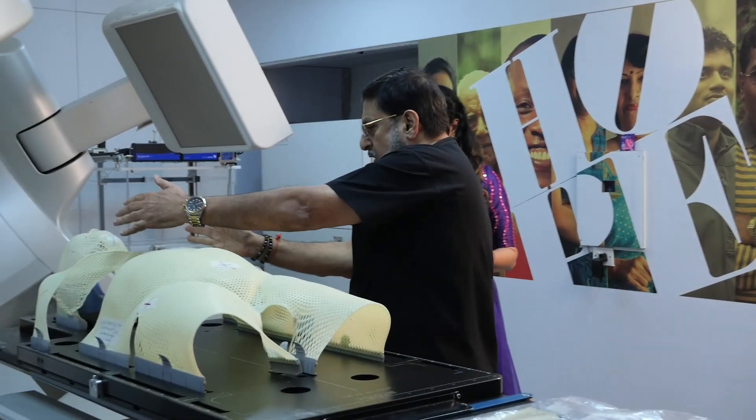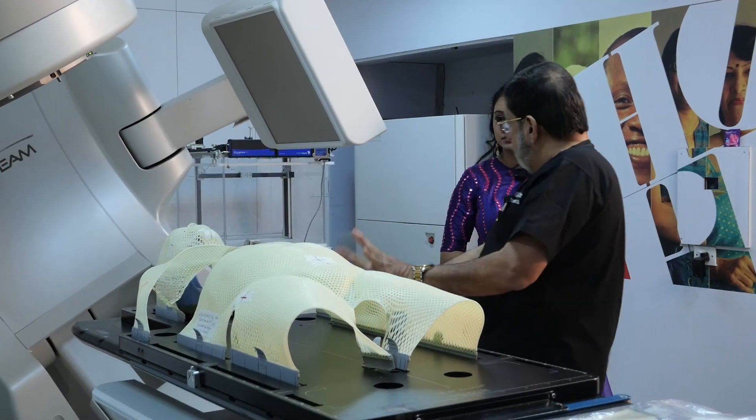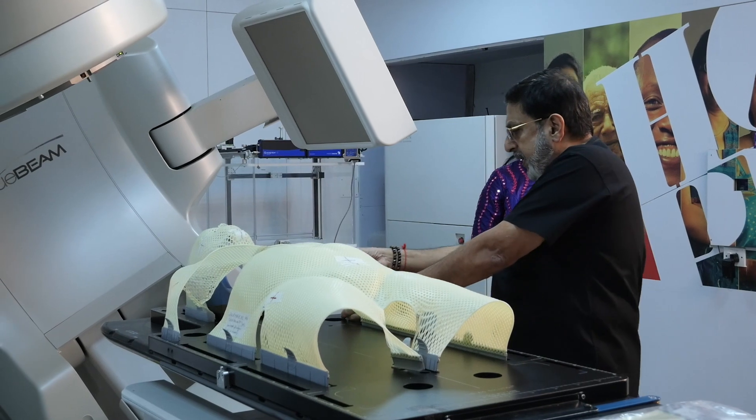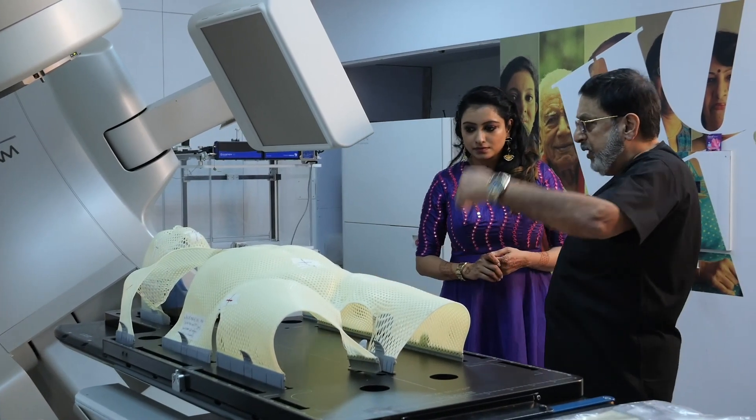It takes the configuration of the body of the patient, and once it takes the configuration we allow it to cool, then it takes the same shape of the patient. It becomes a rigid material, and with this aquaplast we do the CT scan.